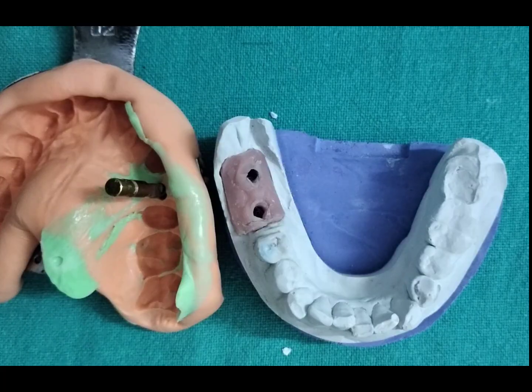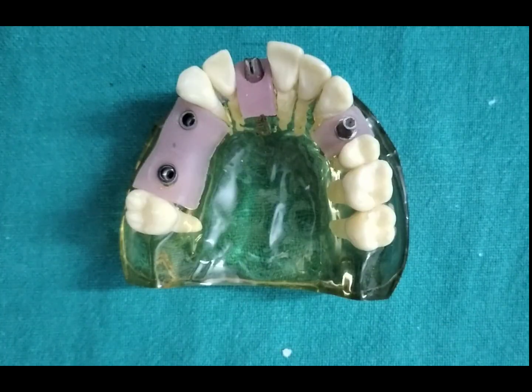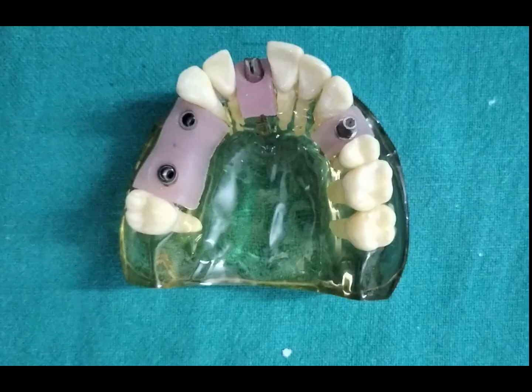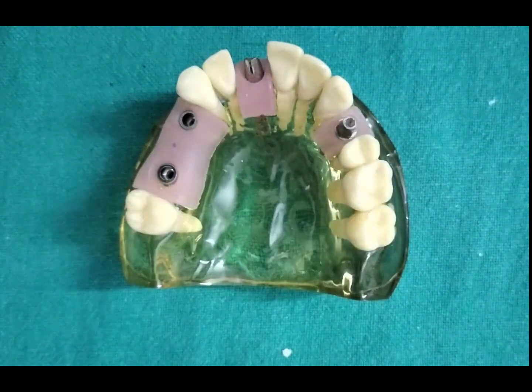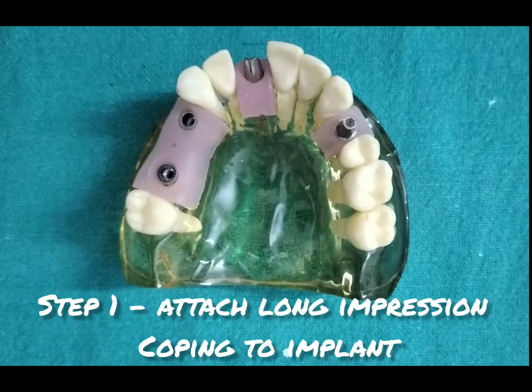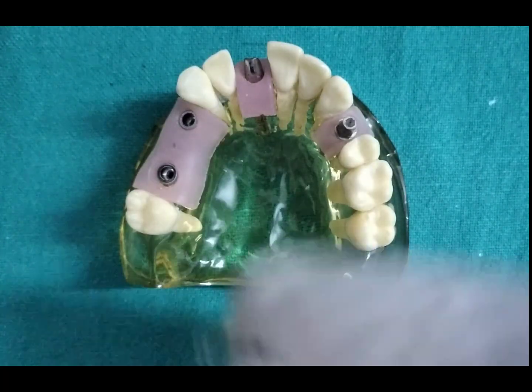Next technique is the open tray technique. Open tray technique is also known as the direct technique or the pickup technique. Now this technique is used for cases where we have to take an impression of multiple implants. Like in this situation, suppose I have to take an impression of all these 4 implants, then I will prefer an open tray technique. Now how is it done? Step 1 is you attach the impression coping. Here the impression coping which you are using is the long impression coping.